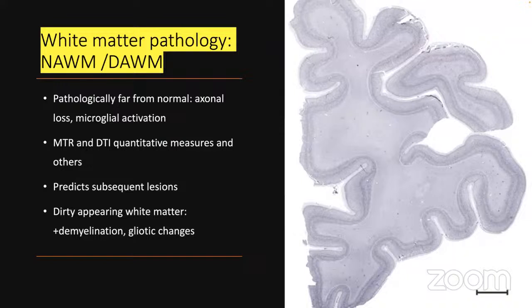Another technique, based on the diffusion-weighted MRI sequence, is called DTI, diffusion tensor imaging, which is largely reflective of axonal integrity, because it picks up how the water trafficking within an axon performs. You will be able to detect problems with this trafficking of the water content in normal appearing white matter. So far, you would conclude that this is just normal appearing white matter. However, this is not all the fun.